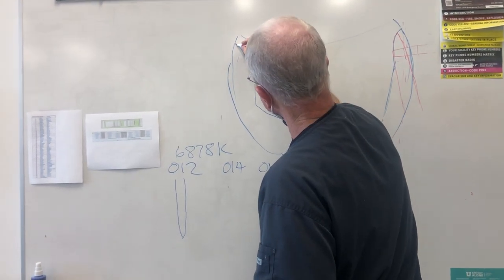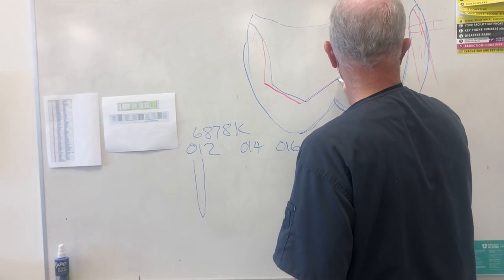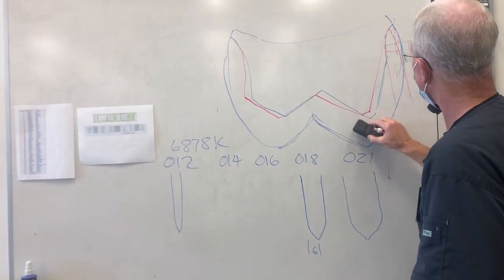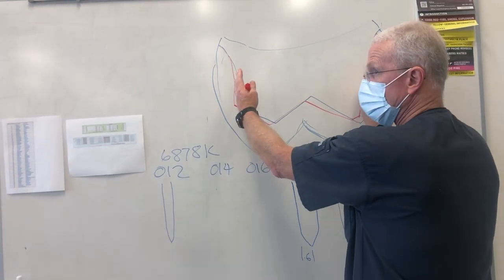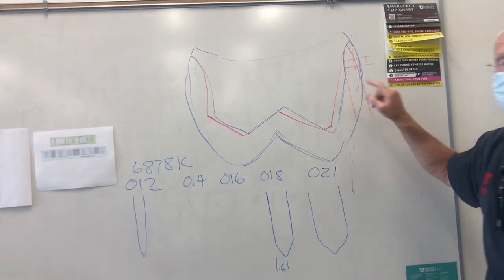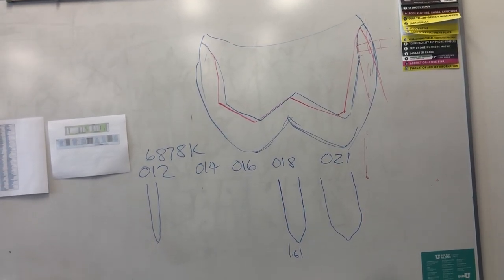So if it was a little bit more like this, one of two things is going to happen. I may over taper it a little bit to get the clearance over here, to get the space. But if the axis is simply more to the lingual, I may not need to do two-plane facial reduction. But remember, with most of these teeth, your axis is to the buccal a little bit because of the curve of Wilson.